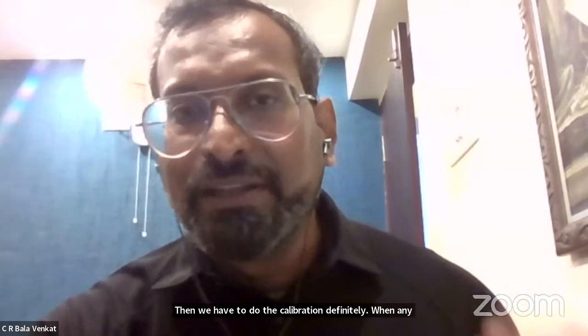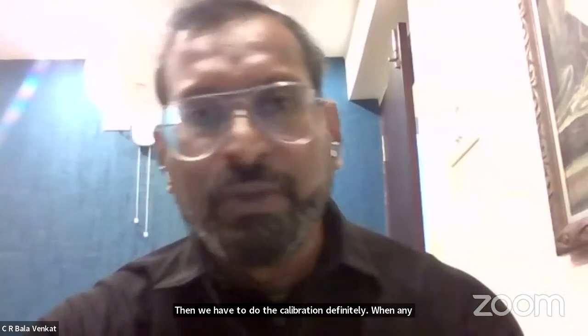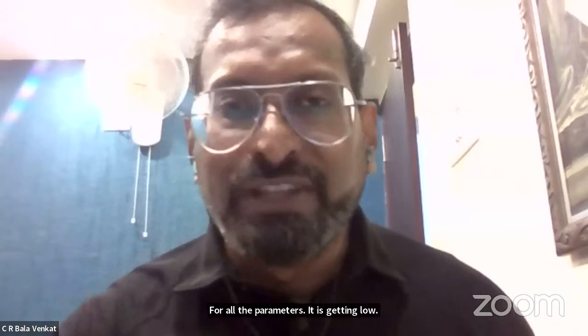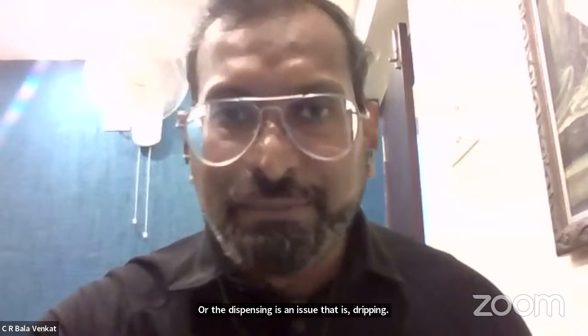When we have to do the calibration: definitely when any part is replaced, when there is a problem with the dispensing, or when they run controls and everything is going negative bias. So when they find those kinds of indicators in their parameters, for example all the parameters are getting low, or the dispensing is an issue, that is dripping, then after the service, they have to do the calibration.